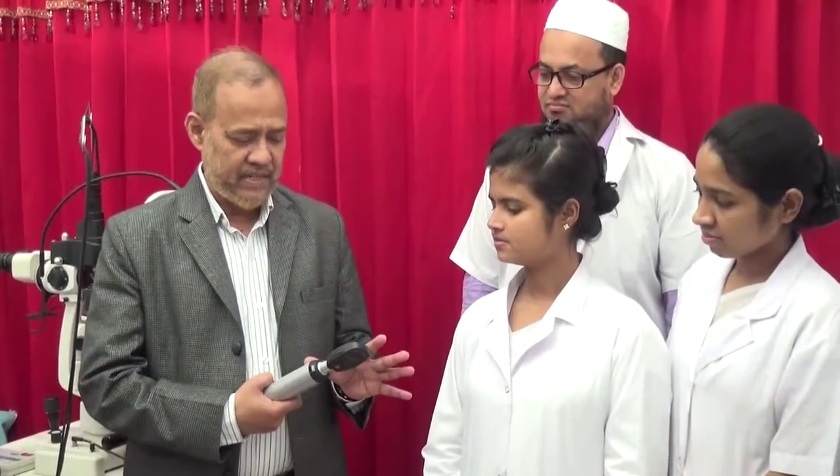I am going to introduce one latest equipment known as ArcLight. Before that, I want to show the direct ophthalmoscope which we have been using for many years to see the retina and the optic disc. But this equipment has three disadvantages: number one, it is costly; number two, we can't document the retina findings with this equipment; number three, it needs battery. So this is not suitable for developing countries.